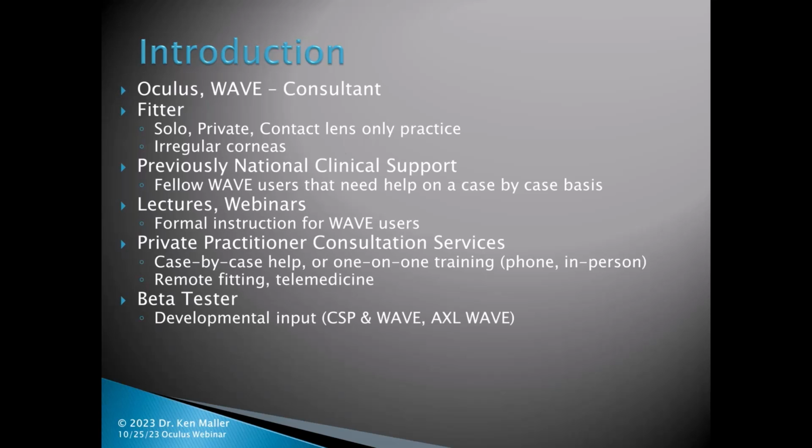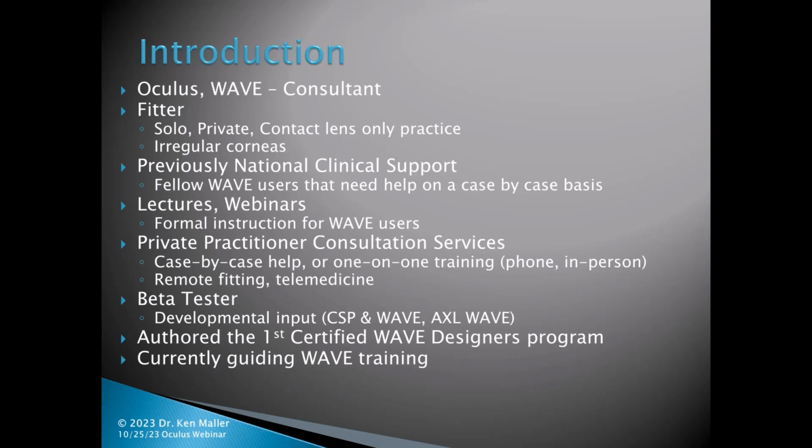I do beta testing for both the Wave software as well as the CSP software, and also am given some input on the AXL Wave Pentacam unit. I did author the first Wave Designers Program for certification, and I'm currently guiding the Wave training program. Also, I'm involved in a project now, it's very exciting, about artificial intelligence trying to assist in getting scleral lenses designed even more efficiently than we can do utilizing the power of both the Pentacam and the Wave software.